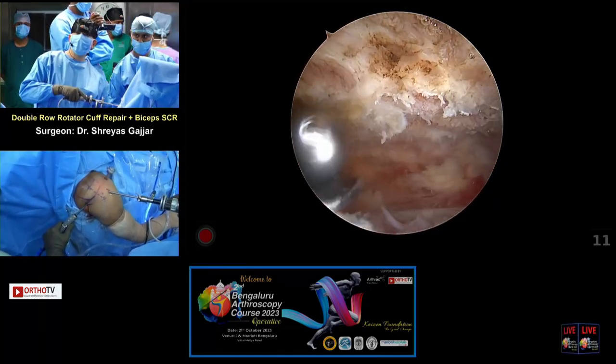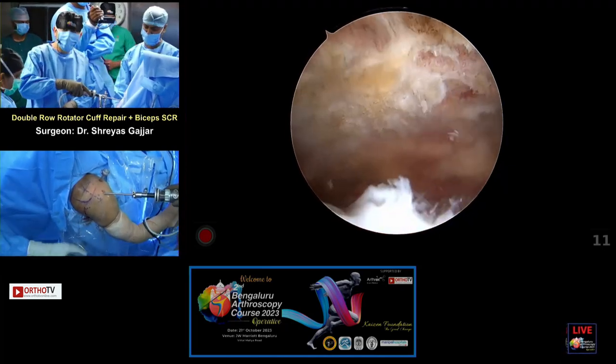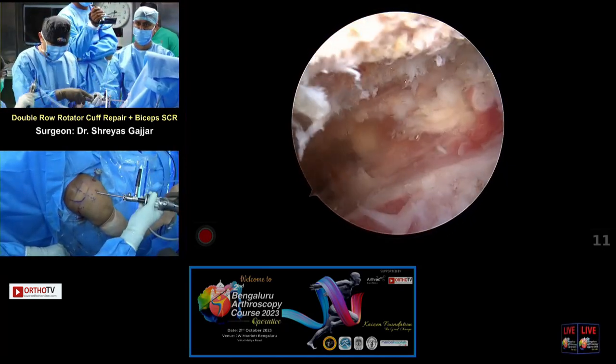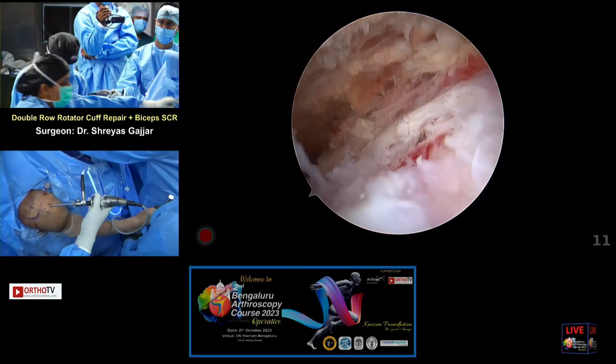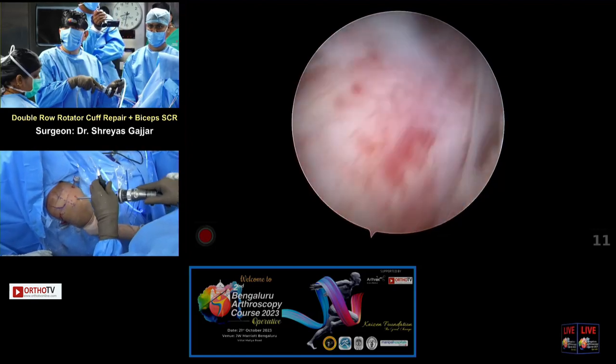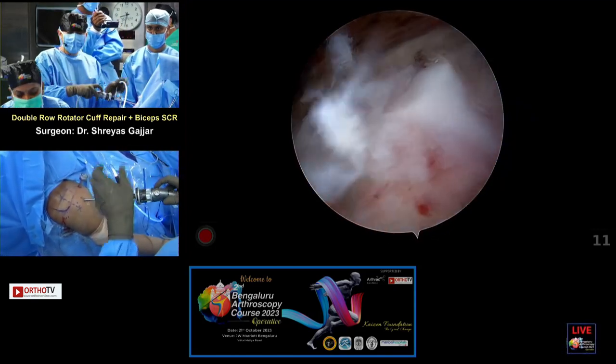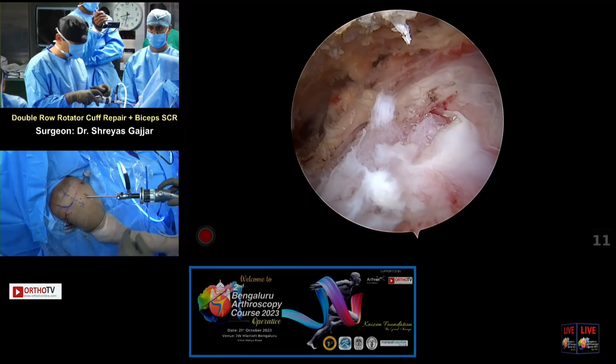So I think this is good enough for me. Now I'll proceed to the cuff repair. So, that's the tear here. Sister, can we put a shaver blade, please?